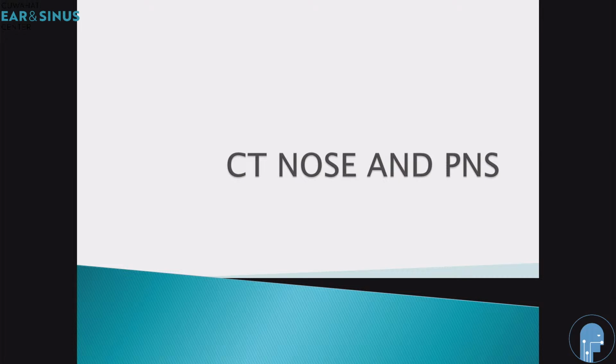Good afternoon, all my teachers and colleagues. Today we will read through a CT scan of paranasal sinus, touching upon the important landmarks without going into too much theoretical detail. We usually give the CT scan of PNS for diagnosis of sinus disease and once diagnosed and taken up for surgery, it is extremely important for planning of the surgery as it gives us information about various structures and gives us a roadmap for safe surgery.